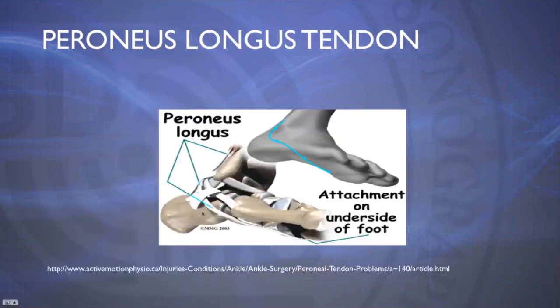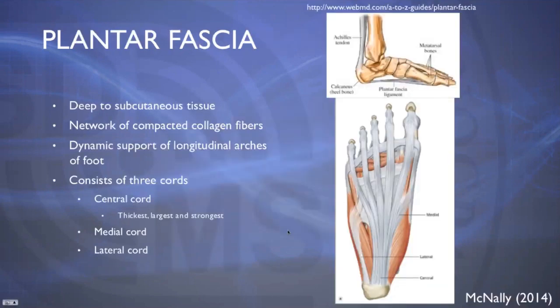And then this is how the peroneus longus is going to insert. You can see how it goes, and it will attach on the underside of the foot. The plantar fascia now is going to be what we're looking at, the bottommost aspect of the foot.